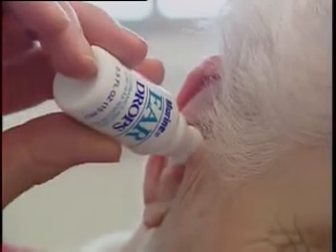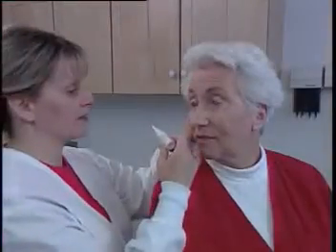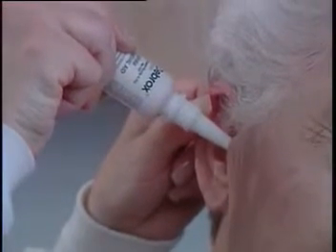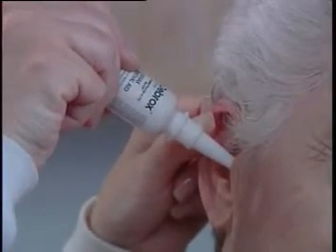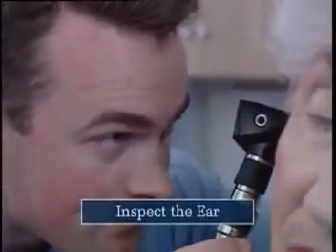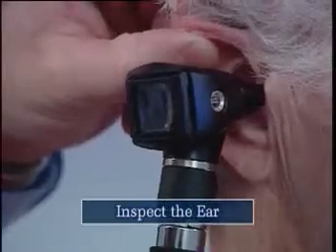When scheduling a patient for ear irrigation, ask your patient to use a cerumenolytic prior to the appointment. If this isn't possible, apply a few drops of wax softener about 20 minutes before the procedure. While wax softeners aren't necessary, they complement use of the ear wash system. Always inspect the ear before attempting any irrigation.